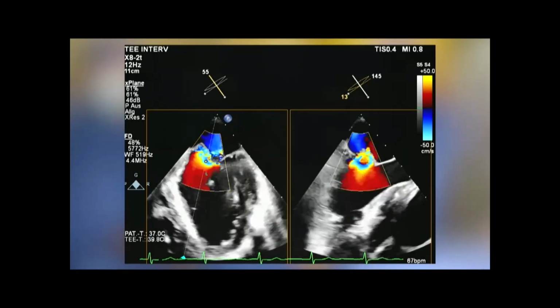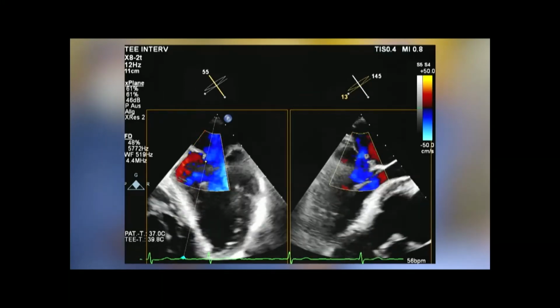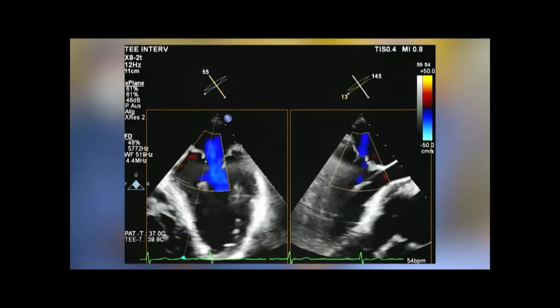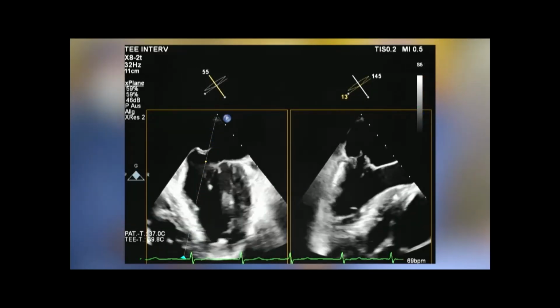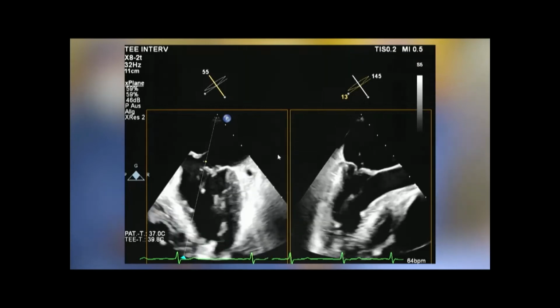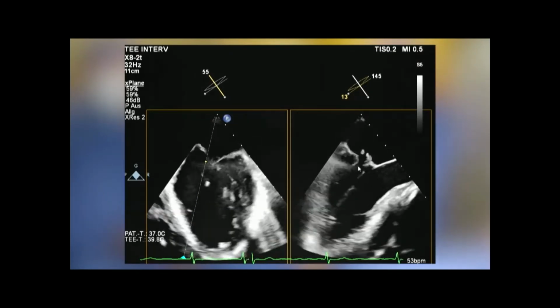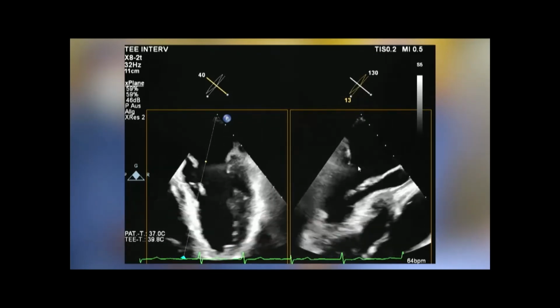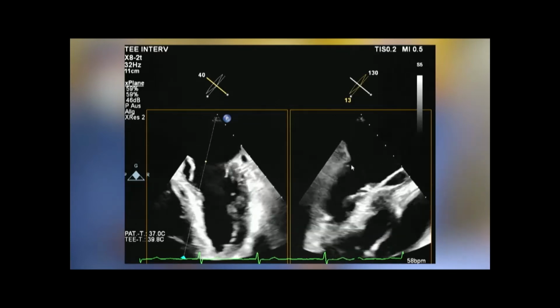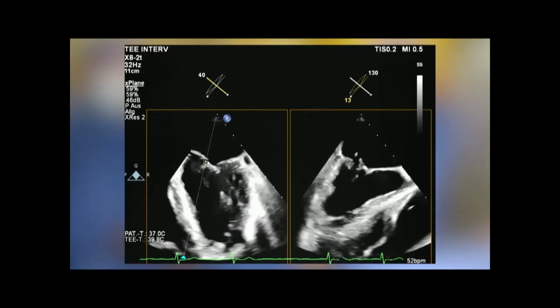Yeah, effective regurgitation orifice area of 0.9, which is really huge. We have no systolic reversal due to the eccentric origin of the jet. And you see in the commissural leaflet, you see that very nicely, that we don't see a coaptation point here. So we have to adjust the angle in X-plane, and now you see here that flail leaflet with that ruptured cord on the left side.